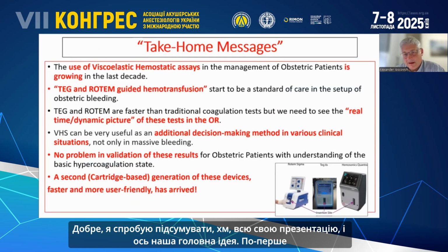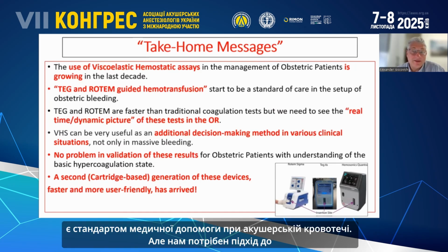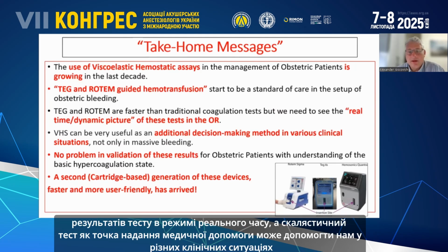Okay, I will try to summarize my presentation, and this is our take-home message. First of all, the use of viscoelastic hemostatic assays is rapidly growing. TEG or ROTEM guided hemotransfusion is a standard of care in the setup of obstetric bleeding, but we need a real-time approach to the test results.